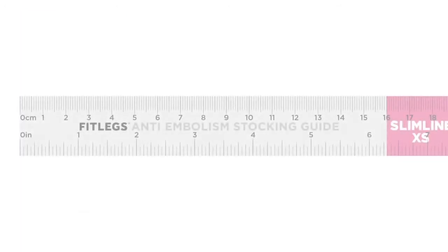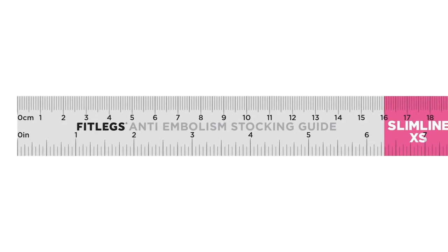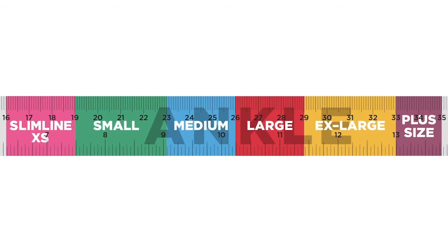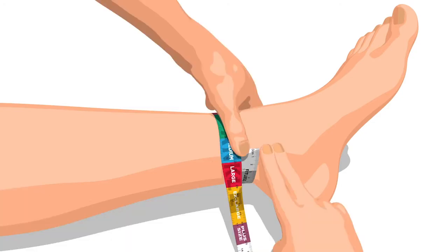To measure for a below-knee FITLEGS Anti-Embolism Stocking, only one simple measurement is required to obtain the correct size. This can be done with a single-use color-coded tape measure, which will clearly show the size the patient should be fitted with. For the below-knee stocking, start by measuring the ankle. The ankle circumference is measured in centimeters, 2 finger widths above the ankle bone.